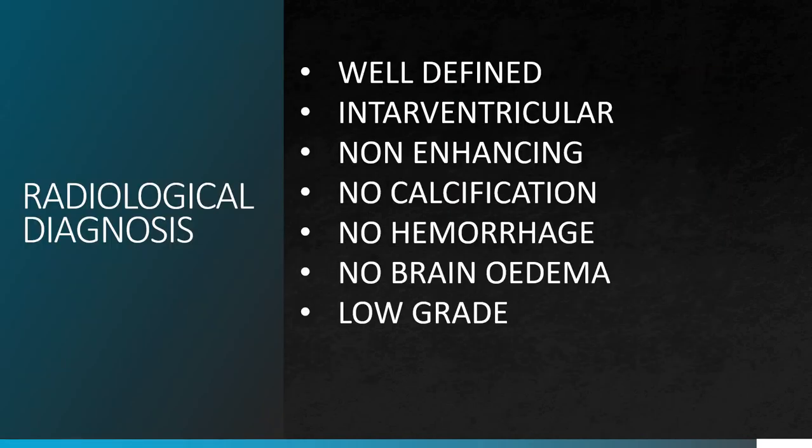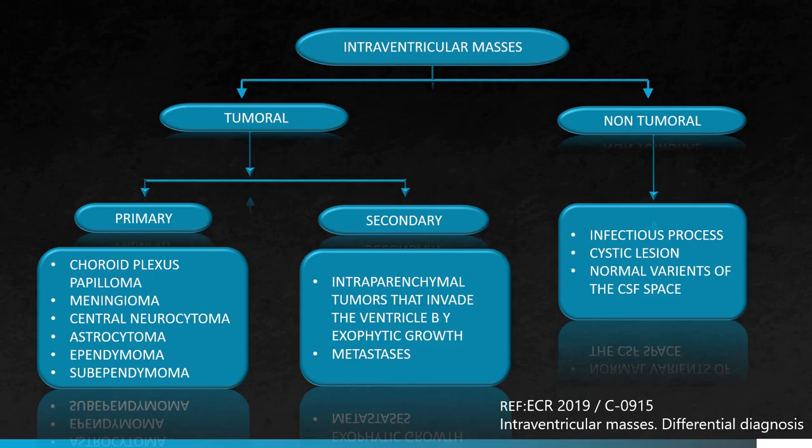So far what we know is: the lesion is well defined, intraventricular in location, it is non-enhancing, does not show any calcification or hemorrhage, does not show any brain edema, and it appears to be low grade in nature.